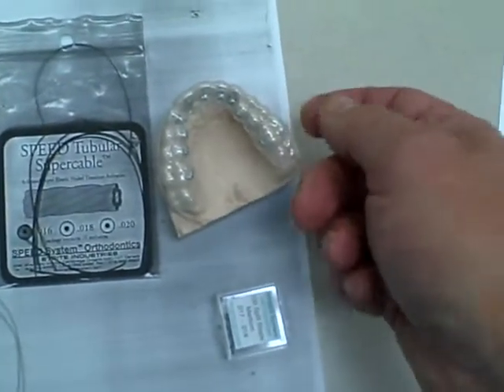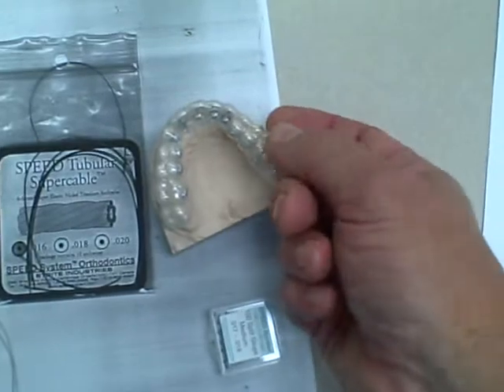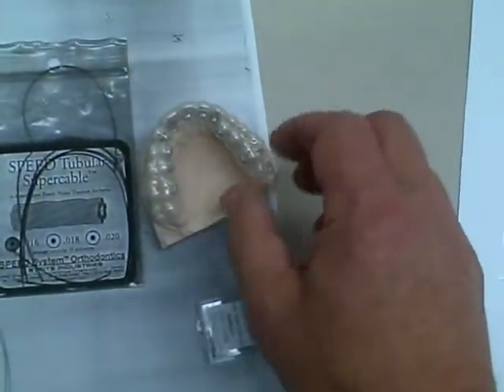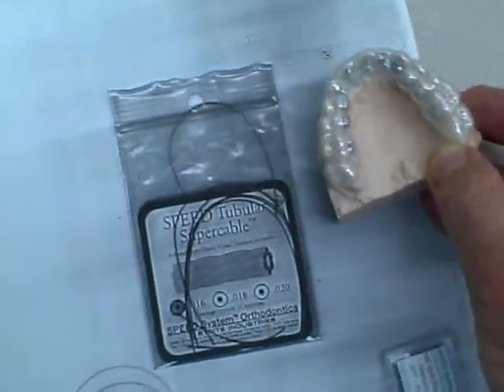At that point, you can tease the tray off, and I typically tease it off from the buccal back to the lingual so that you can slide it up underneath these bracket wings. You can imagine the bracket wing back in here that if you get it caught, you're going to pull a bracket loose. I've blocked out the cuspid, the hook on the molars, but it's still kind of hard to do, and I'll use a hemostat and a finger and very gently tug along until it comes out. Then I repeat for the other tray.